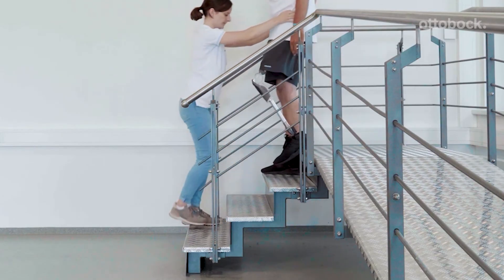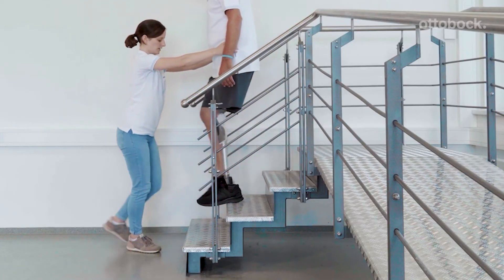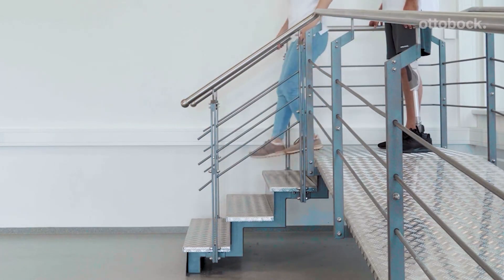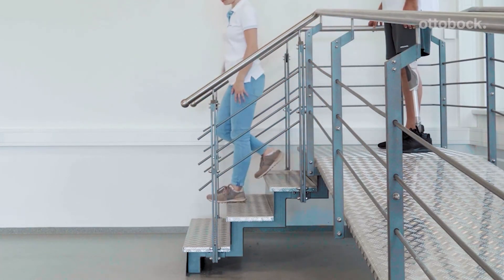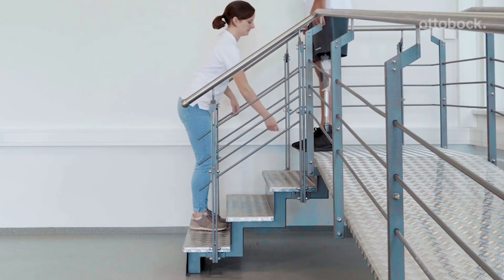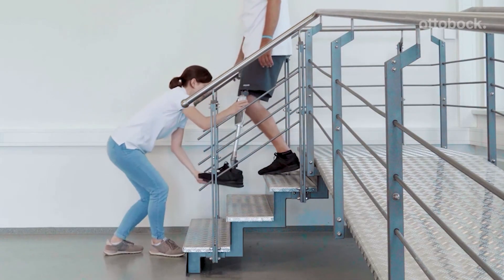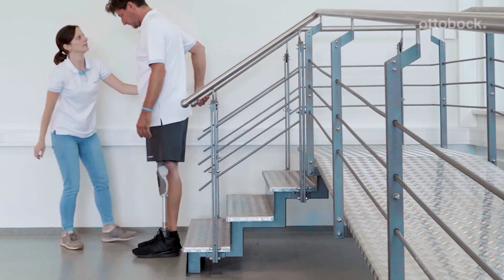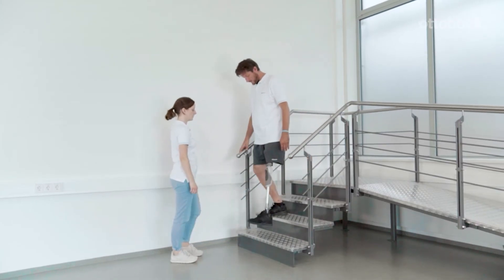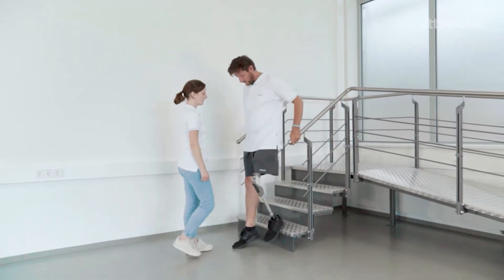Correct placement of the foot is a common challenge. The foot can easily slip if placed too far forward. If placed too far back, the knee may stay extended, or stance release can be triggered accidentally. Proper foot placement is also important for walking downstairs step over step. Start the training using the contralateral handrail and make sure the upper body stays upright. Use of the ipsilateral handrail increases the intensity of training, because the model must load the prosthetic side more.